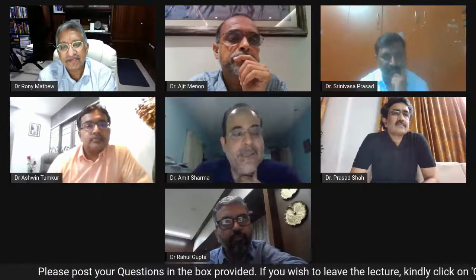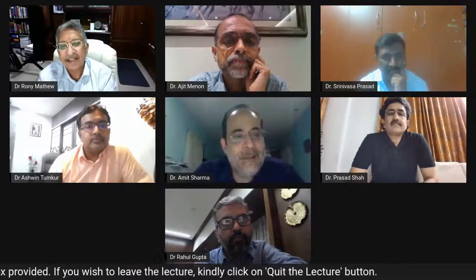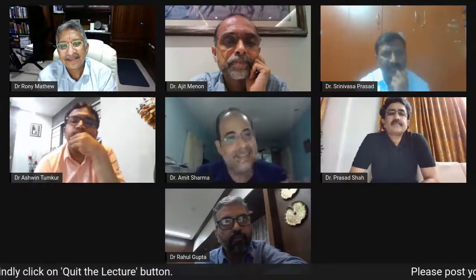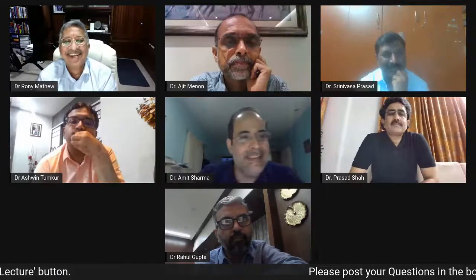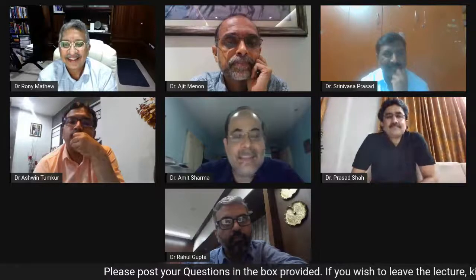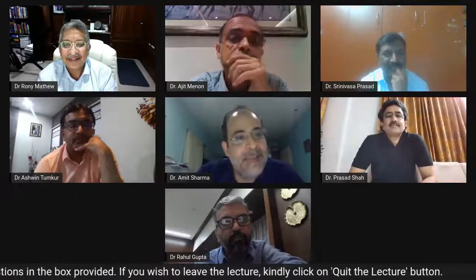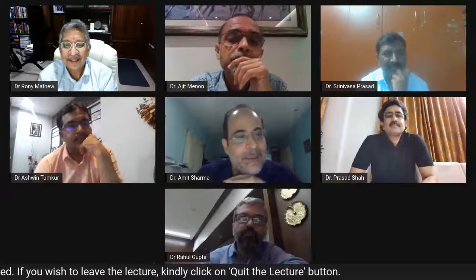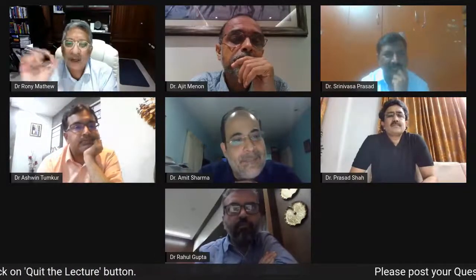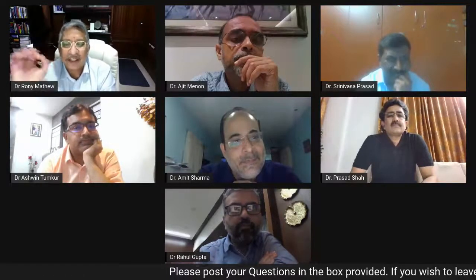I agree with you, sir. And the circumflex also was a decent sized vessel. It was almost 3 plus. So yes, that was weighing on my mind. But all the time when you see an 83-year-old, you say, no, let's just secure that left main LAD, and that kind of thing was playing on my mind. And yes, I agree with you, and in hindsight, I also feel that maybe I should have done a TAP and probably got that also, because if you have an OCT on the shelf, you can very safely go into the left bifurcation, distal bifurcation.